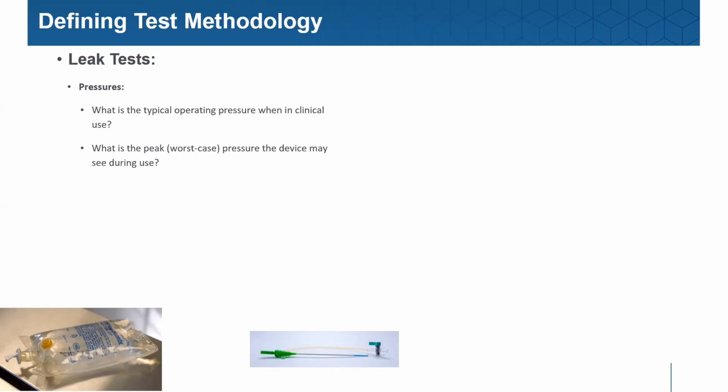Contrast solution components are a very common application for this, where a syringe injecting contrast solution at high pressures is used. Those applications can see some definite spikes during operation.